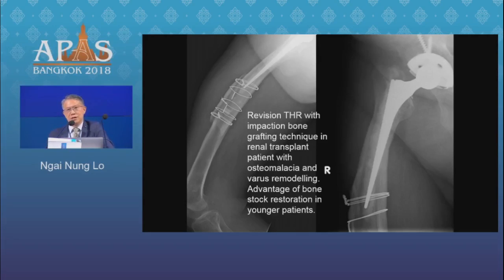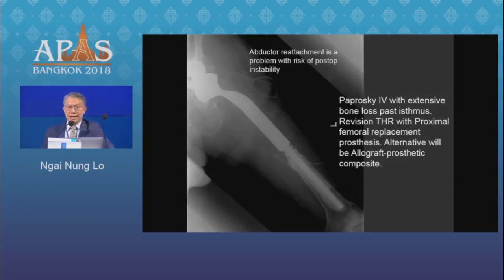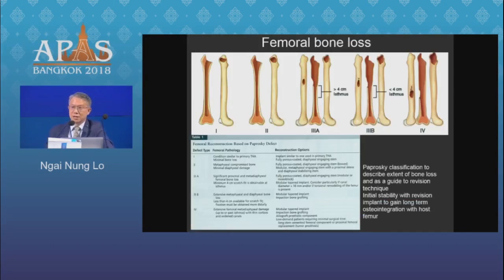And here you could consider things like impaction grafting, where instead of trying to go longer and longer down the canal, because there's really nothing to support you distally, maybe you go short, plug the femur proximally, fill it with impaction graft and cement in a short stem, and allow for some biologic restoration. A technique that is difficult to do, and for people without the support of a bone bank, sometimes not so easy. And then, of course, you consider things like mega prostheses, tumor-type reconstruction prostheses.